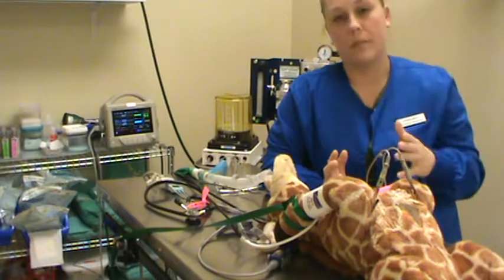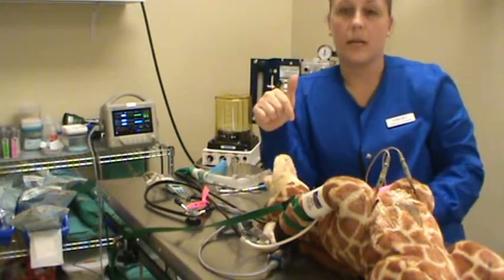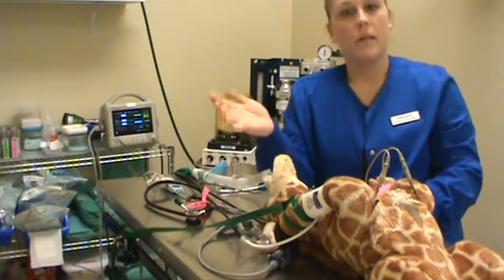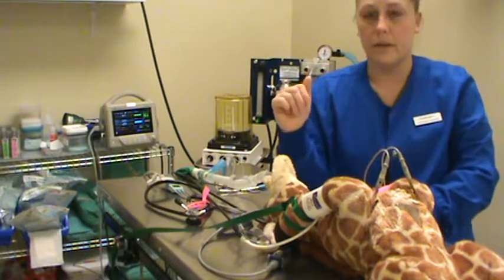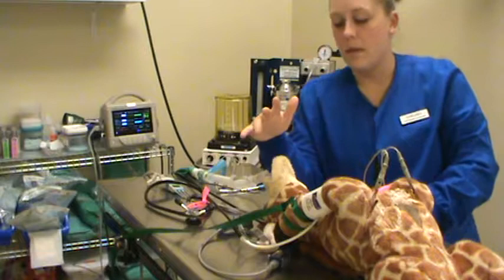You're also going to lose one last reflex. It might be slow or absent, which is the PLR. So you shine a little light in both of the eyes and see if those pupils constrict. If they constrict slowly, or it might be absent, that's another way to tell if your patient is really deep. So if there's no PLR, the patient is pretty deep, stage 3, plane 3.